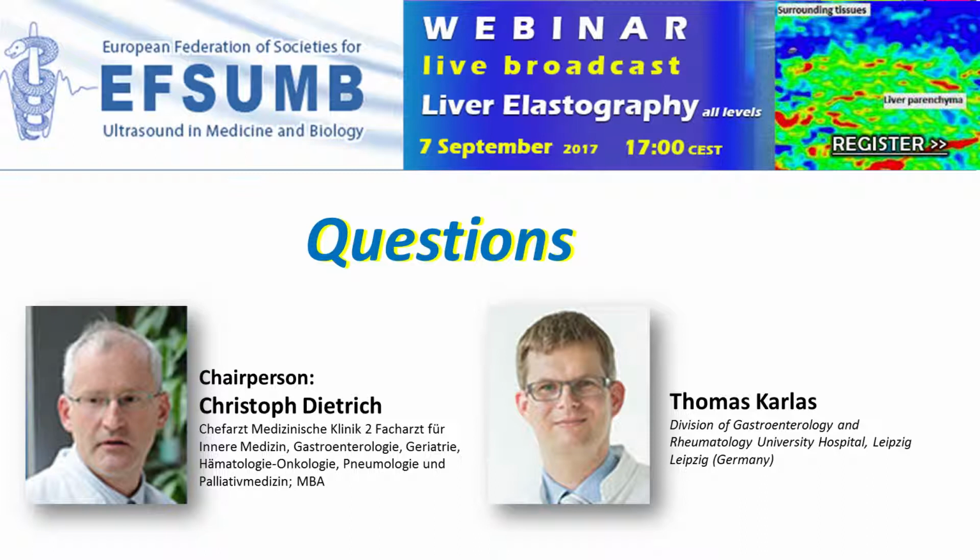Thank you so much. What is the main advantage between point shear wave elastography and 2D shear wave elastography? Yeah, point shear wave elastography was the first method which was available for the market, and many studies have been performed using this technique. So it's better evaluated in chronic liver disease than 2D shear wave elastography is. The advantage is that you have a small region of interest which you can place wherever you want, and you can precisely avoid vascular structures or bile ducts.